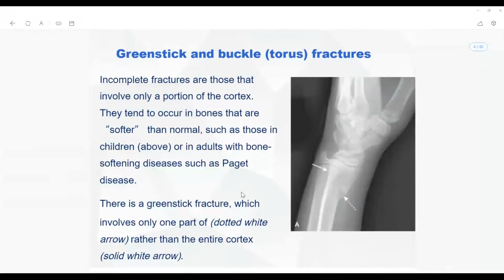So you see here, I gave the same kind of history with the same kind of action dynamics description, I just changed the age of the person, the diagnosis changed, and the x-ray appearance remains the same. Did you understand this one? So please do not make a mistake like this.